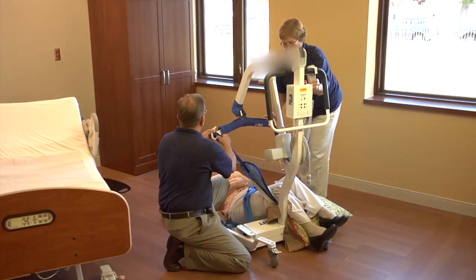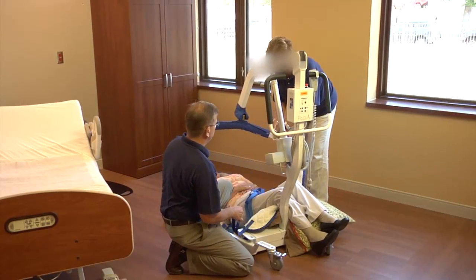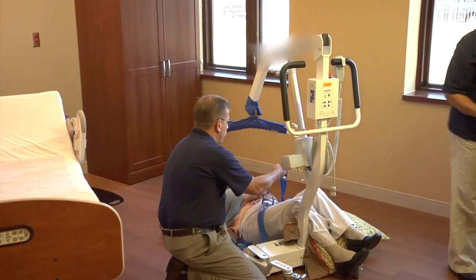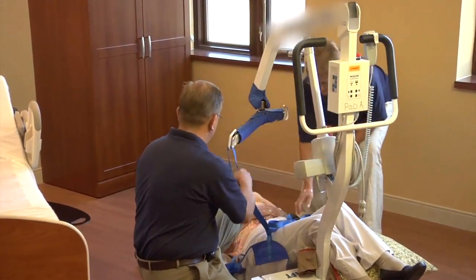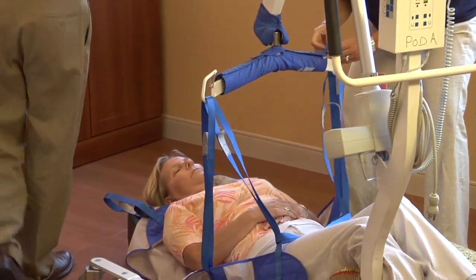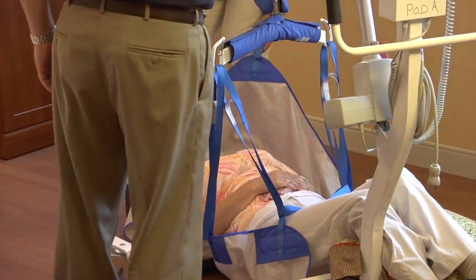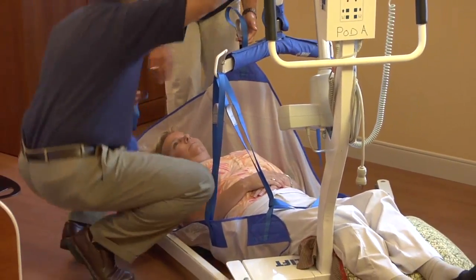Remove the limb strap. The lift is in the right position, and we're going to start to attach our straps. Mechanically lifting a patient off the floor can be done with 2 people, and if 4 or 5 people show up, it can be done with that many people. The thing to remember is you're not going to do it manually. You're going to use all your safe patient handling tools and strategies to get the patient off the floor safely and without manual exertion.